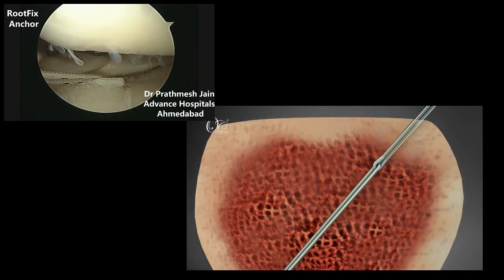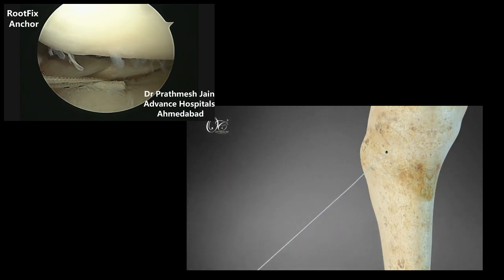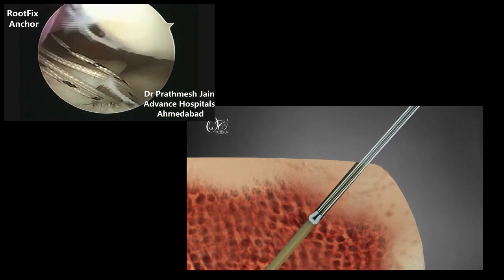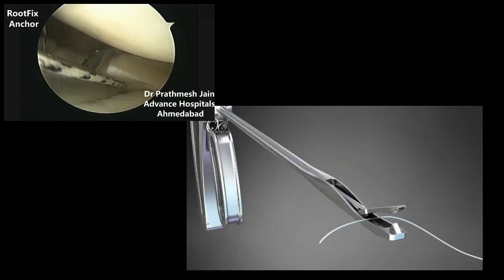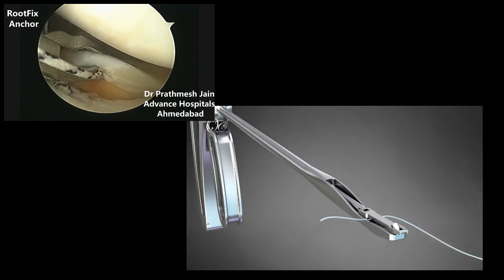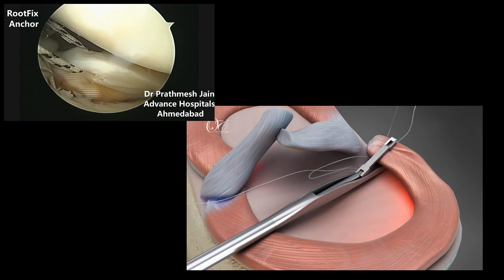Anchor with the OsteoCare Root Fix Anchor in a retrograde manner. As the root fix anchor is installed in the root, which is 3 to 4 mm, pull the strands to check pullout strength. Direct the first fiber strand with the suture passer through the detached meniscus; the accompanying fiber is passed into the meniscus stump.